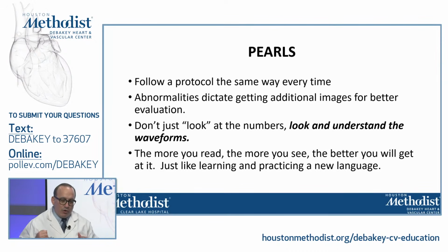The other thing is, the more you read, the more you're going to be able to see, and the more you're going to be able to understand the language that the waveforms are trying to communicate with you. The better you get at it, the better you're going to be. You're going to be able to really read things faster and understand better.